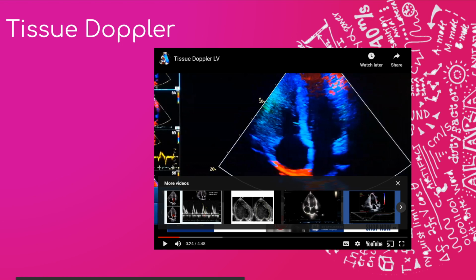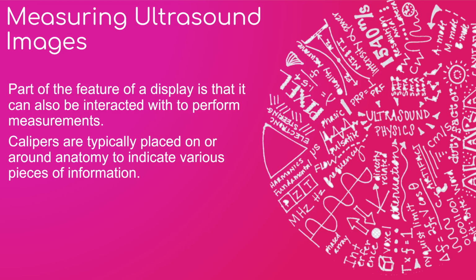Measuring ultrasound images. So this is a pretty basic concept, but one of the mock tests that I had looked through had some questions on it, so I wanted to make sure that we included it in our mishmash unit here. So measuring on the display is actually a feature of the display itself. We know that our displays are capable of displaying the grayscale images due to however many bits are assigned, but it also is able to display some red, blue, and green. There's actually more pixels doing some extra stuff in there.